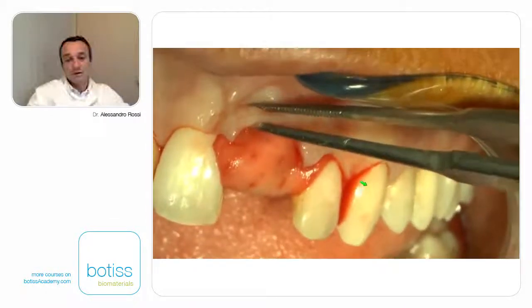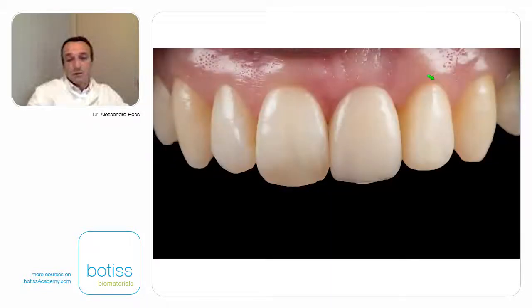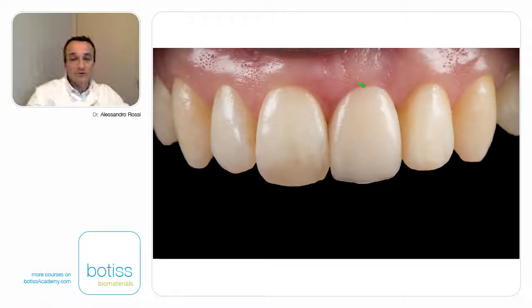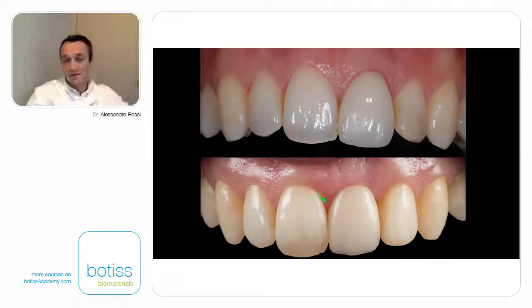Then stitches to achieve closure, and then we insert an implant in this area. The prosthodontist Dr. Diego Lopes made the prosthetic evaluation to achieve a good final aesthetic result. What is more important for me is to underline that we have recreated a normal soft tissue contour around our implant and around our crown. Comparing where we started to the result obtained — we are at the temporary crown stage, not yet the final restoration — I think we have a very good result because the soft tissue are in the correct position, and we will not have any problem in the final restoration of this patient.